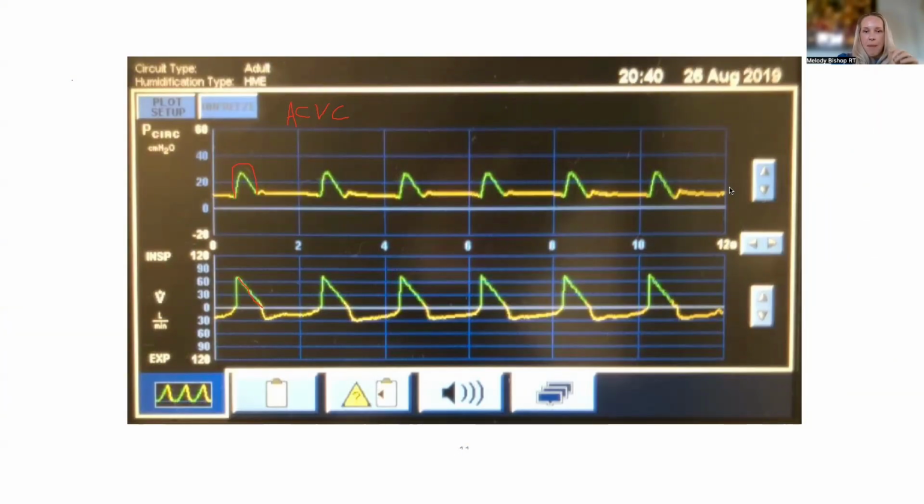100%. My next thing, once I decide what mode I'm in, is to think about which parts of the waveforms I can really look at to see where problems are going to be. With a true volume control, your inspiratory flow is going to be decided by what you set. So I won't necessarily look at my inspiratory flow waveform, but I'm going to look at my expiratory flow waveform to give me clues about the patient, because that will always be patient driven. And I'm also going to look at my pressure waveform. Those would be my next steps.